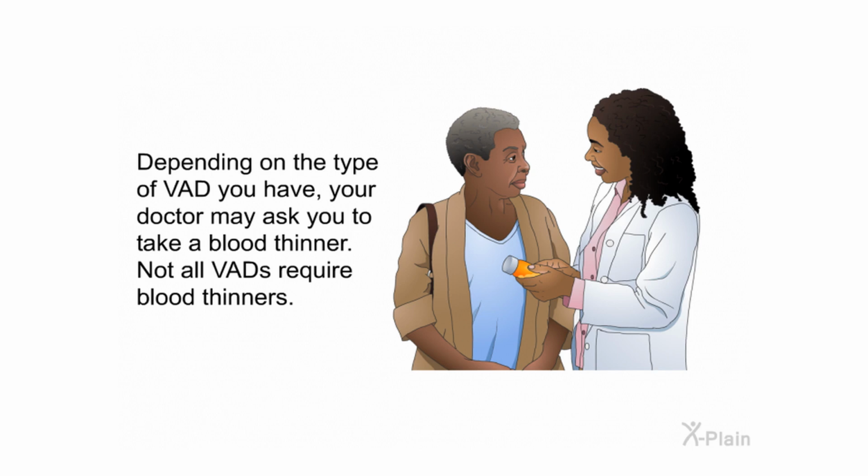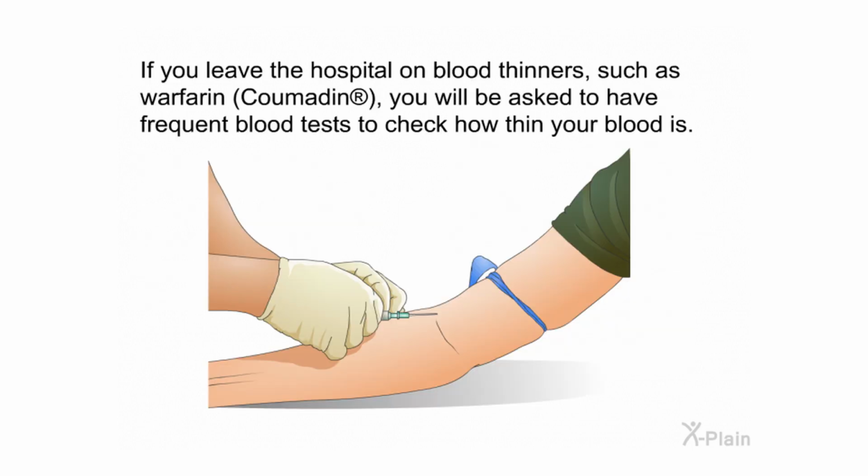Blood thinners. Depending on the type of VAD you have, your doctor may ask you to take a blood thinner. Not all VADs require blood thinners. If you leave the hospital on blood thinners, such as warfarin, Coumadin, you will be asked to have frequent blood tests to check how thin your blood is.